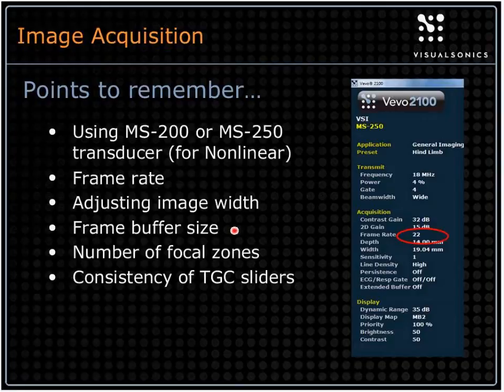This extended buffer adds significantly to the amount of data that you're capturing, so you have to bear that in mind. It may mean more processing, but it gives you a really long run of time to allow data to accrue in the buffer, and for hopefully the bubbles that you've injected to come up to a constant circulating level of perfusion.